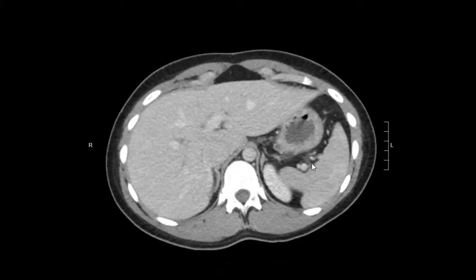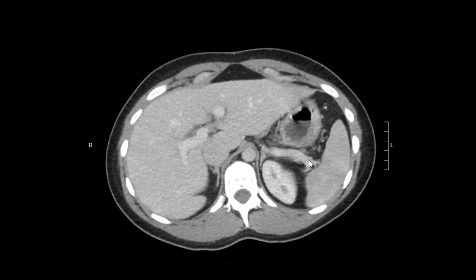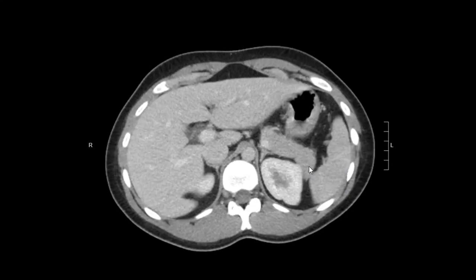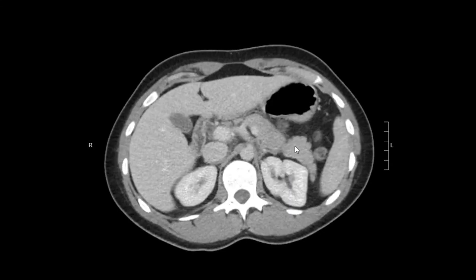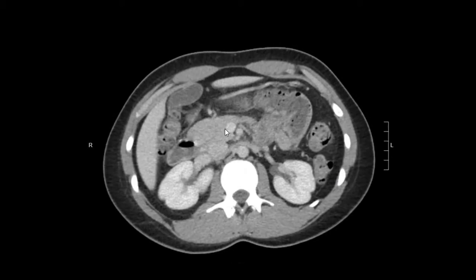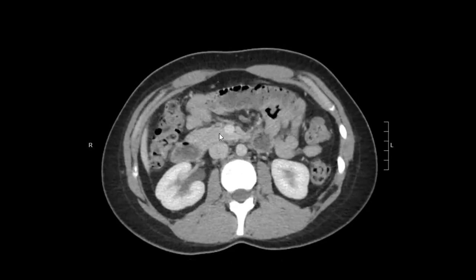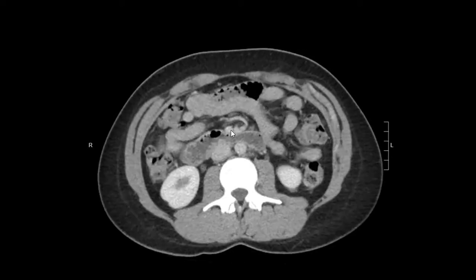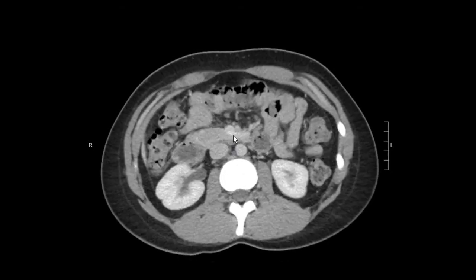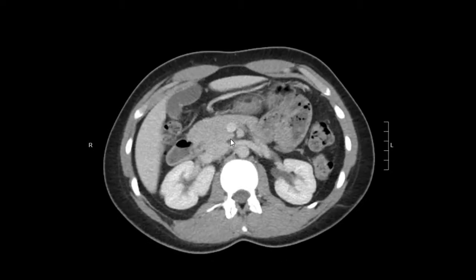We're going to look for the pancreas, looking for the pancreatic tail, which is usually at the splenic hilum. Here it is. And we're going to follow it and look at the whole pancreas. That's normal. This is the head and this is the pancreatic uncinate process. Everything is normal.